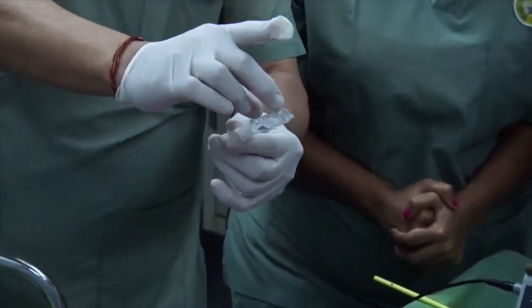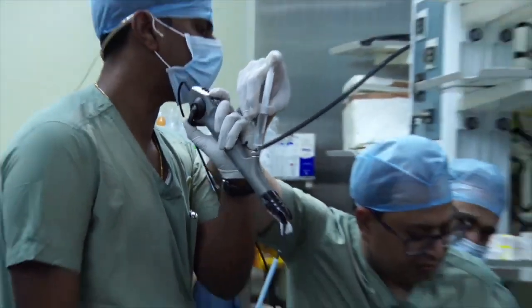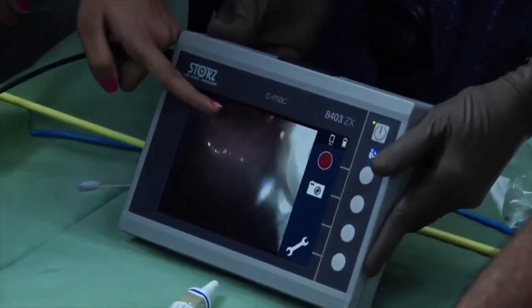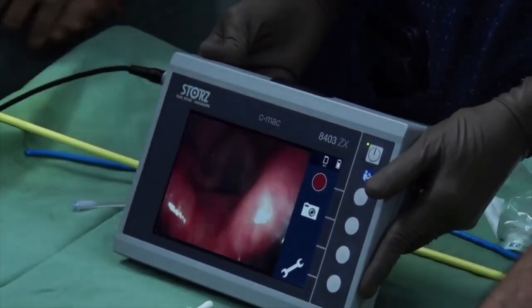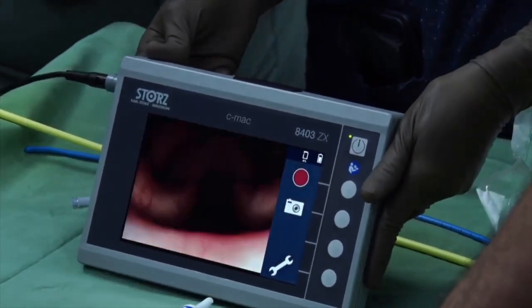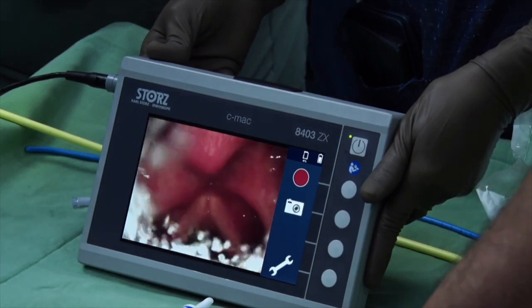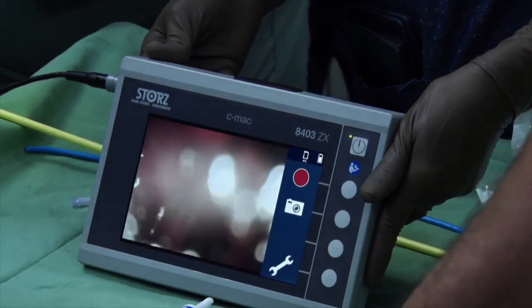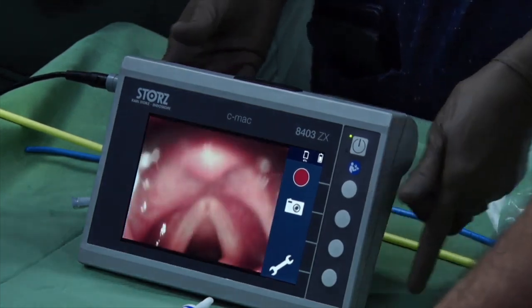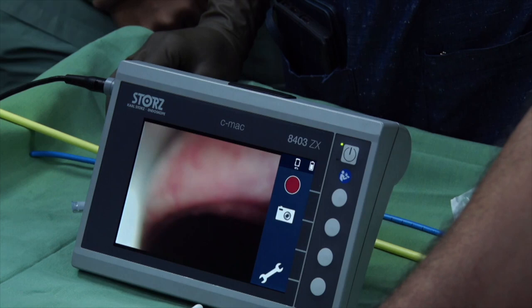I'm going to use two percent lignocaine with air. You need two percent lignocaine along with air for dispersion. I need to see the vocal cords. Going a little further — okay, you can see the vocal cords. You've spread over the vocal cords. The other technique is to use air through that — it disperses the secretions.